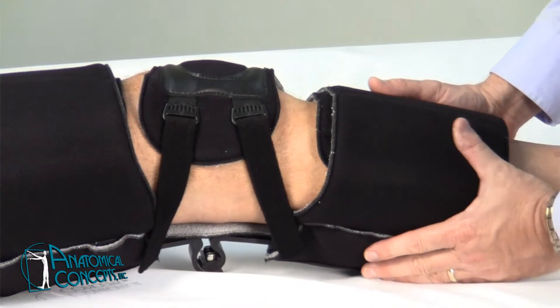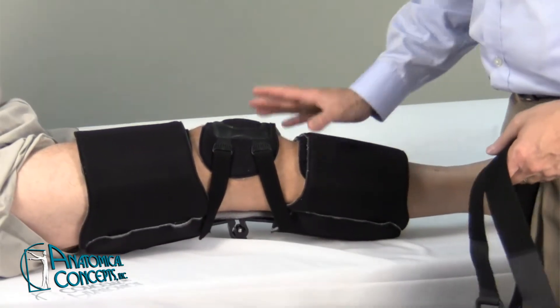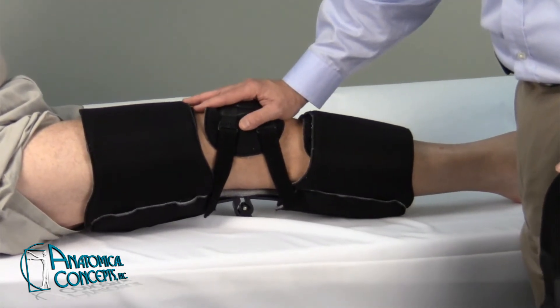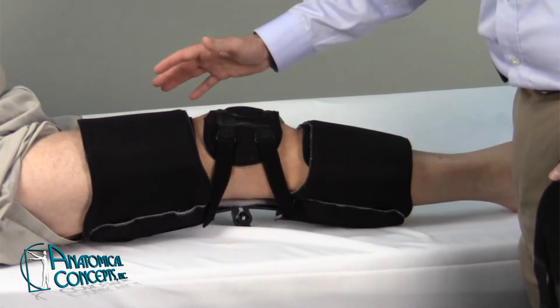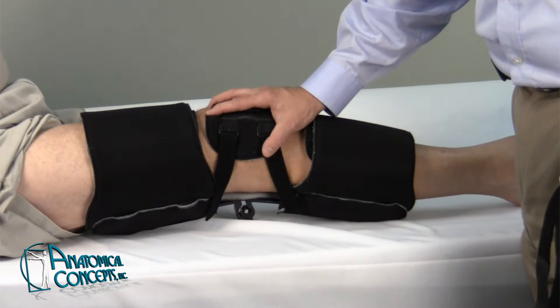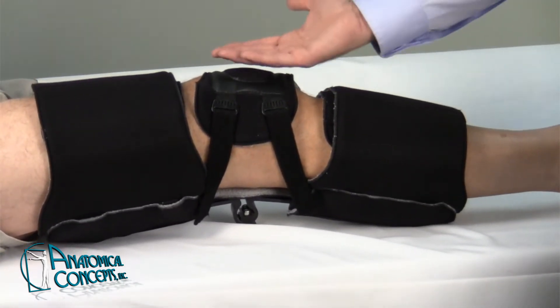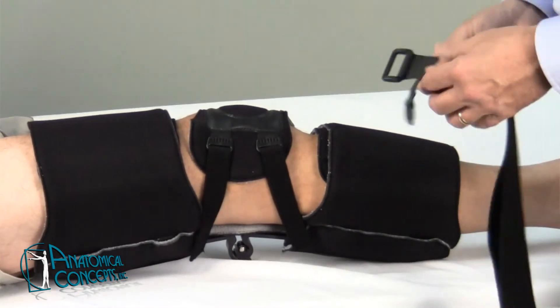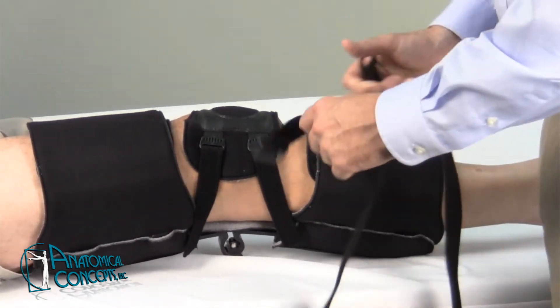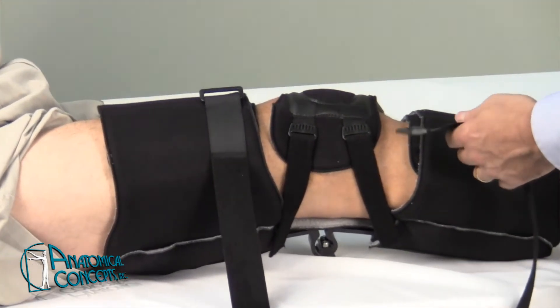And then you have the positioning of the device. We also have two other straps that can be used with or without. In most cases, because of the design of the KMO being a posterior structure opposed by an anterior force over the patella or knee area, that's usually enough force to hold the patient's extremity in an extended or immobilized position. If you feel you need more control and want to keep the leg from bending, you can take one of these straps — available in two different lengths — and place the longer one on the thigh, closest to the knee, for more control.